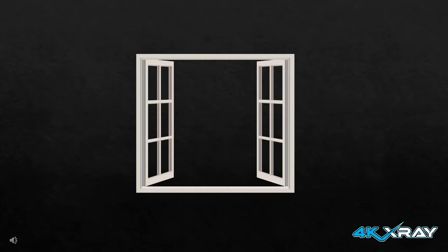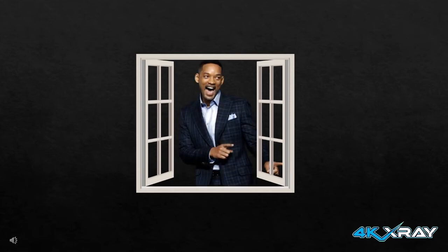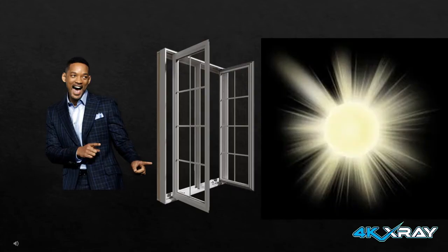So an easy tip to remember window and level is to think of looking from the outside of a window, looking into that window, and you see Will Smith. Now, when you think of this concept, think of Will Smith as being your image, the X-ray, the final result. Where you're standing is on the outside of that window, and think of a bright sun shining in through that window at Will Smith. Depending on how bright that sun is will determine how light or dark our overall X-ray will be.